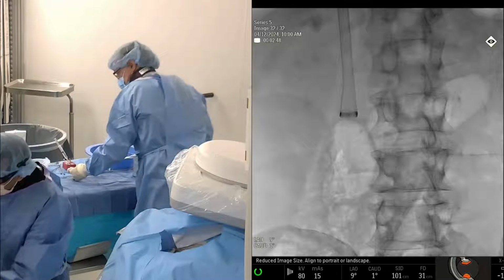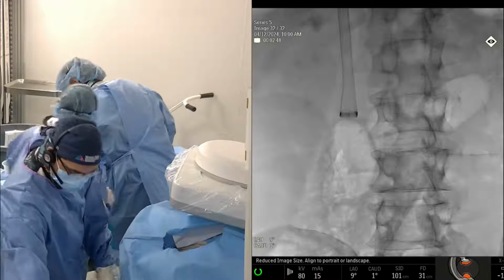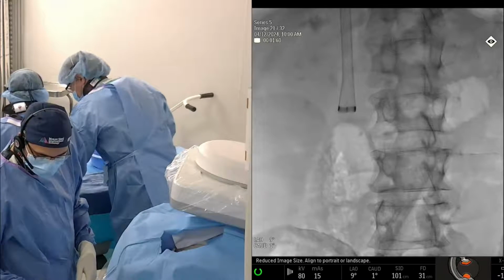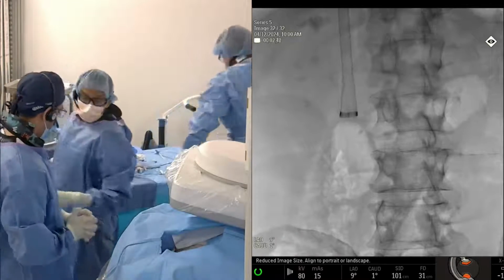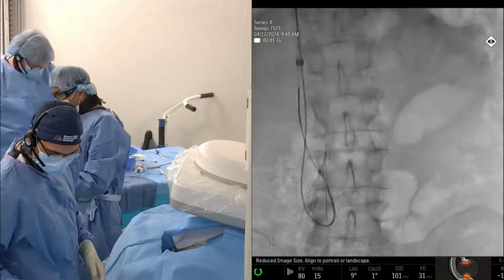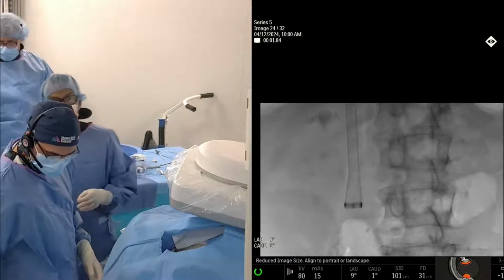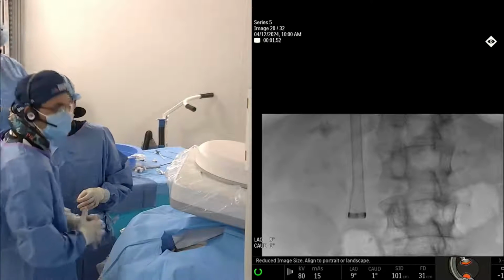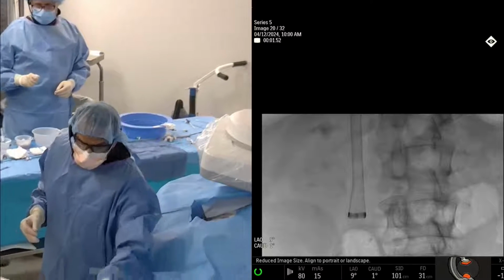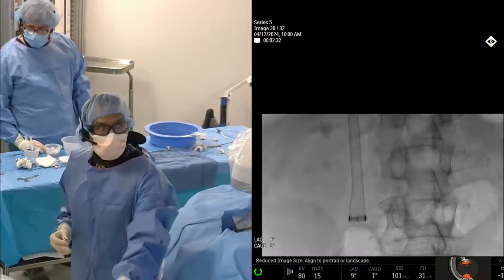You want to save that fluoro and show it? Scott, you want to talk through what you did there? I think it's really important to talk through what you did and how you got yourself to a position where you can get it. So the issue was that we had filter on either side of the graspers that was acting as a cutting device with the sheath. So I let go of where I was, about half a centimeter from the tip of the hook, angled a little more, and grabbed the hook because it was in a better position to grab. Then it converted itself to just being straight and coming out as opposed to being this big cutting device. So I just shimmied up to the hook, basically.